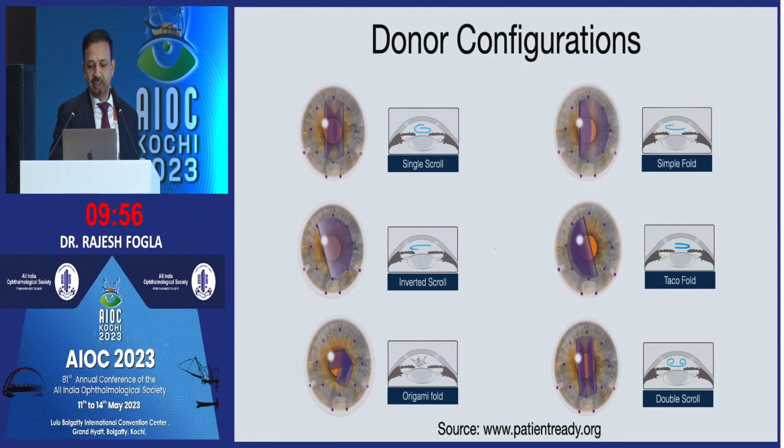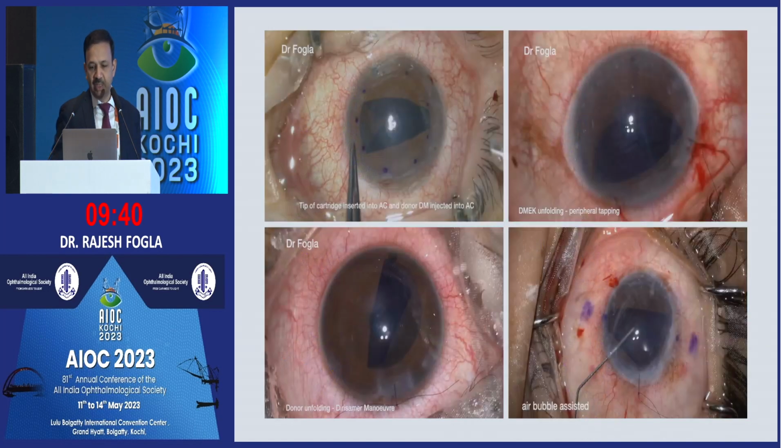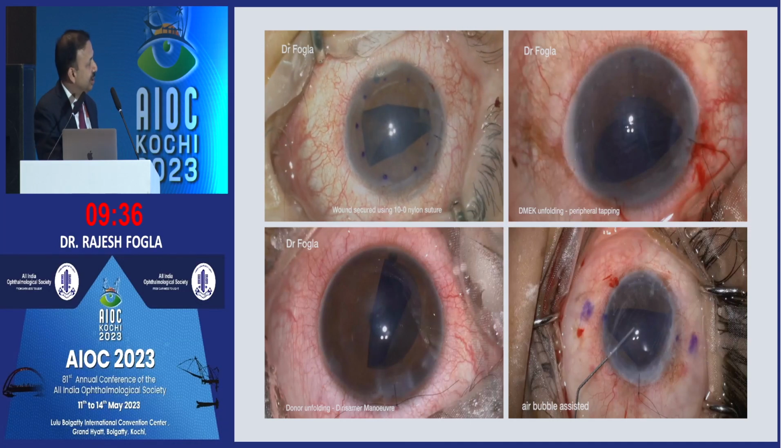So this is the site of Peter Wellman. It's got patientready.org, and it gives very beautiful animation, and it also gives you surgical videos to show you the different kind of scroll configurations and the maneuvers that you can do to get to unfold it. It's a useful resource.